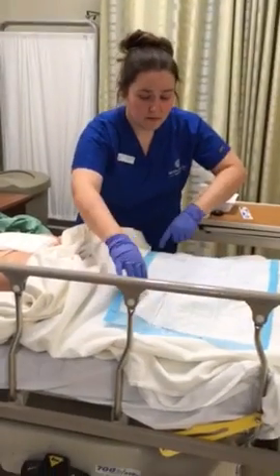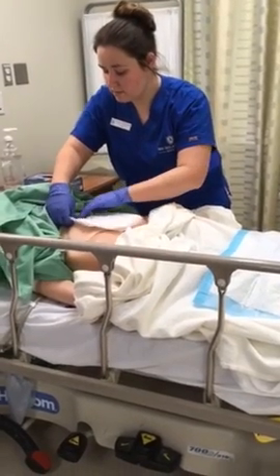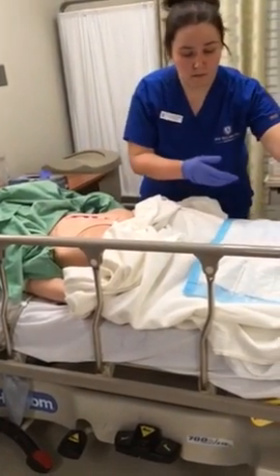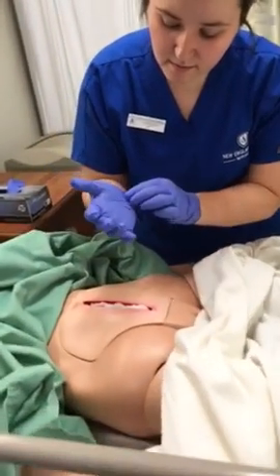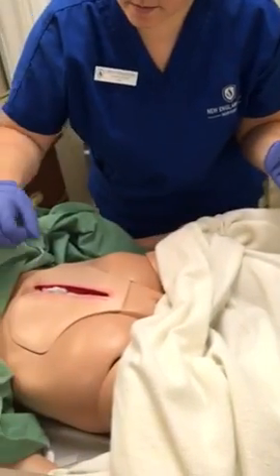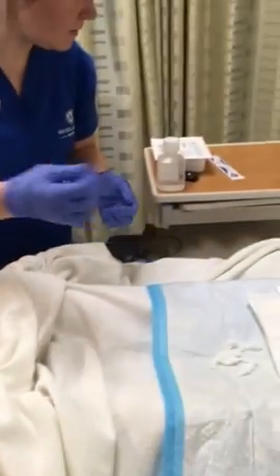Prepare an area for trash. I'm going to hold the patient's skin down while I go ahead and remove the dressing. Okay, I'm going to go ahead and remove the gauze that is currently in the wound and count how many there were. According to the chart, there were 2 placed in. I want to ensure that there are 2 taken out.